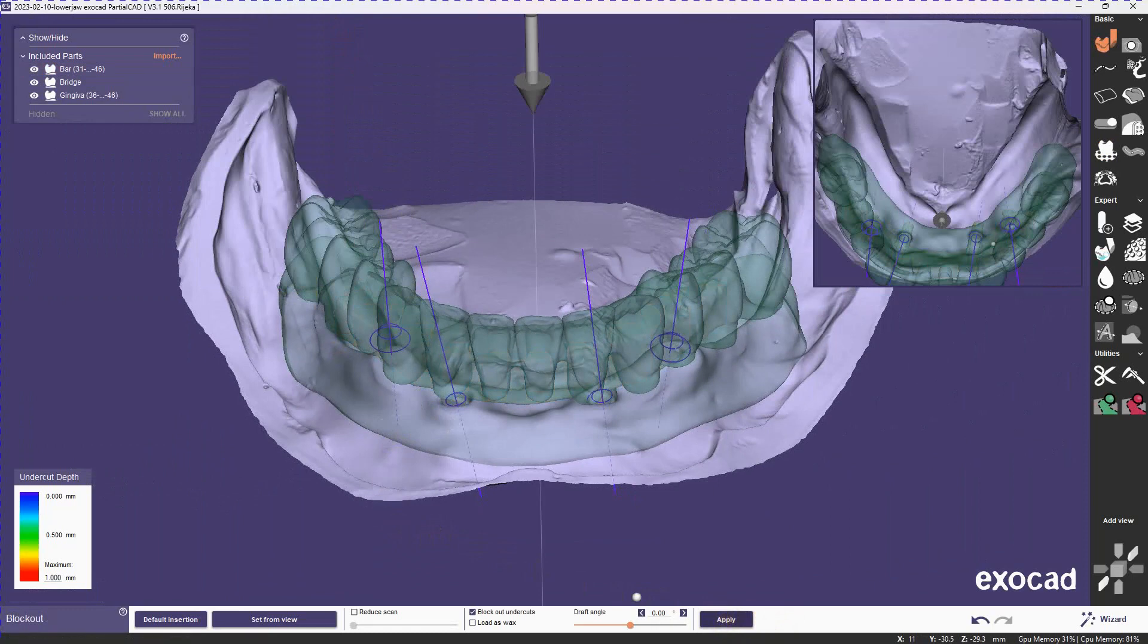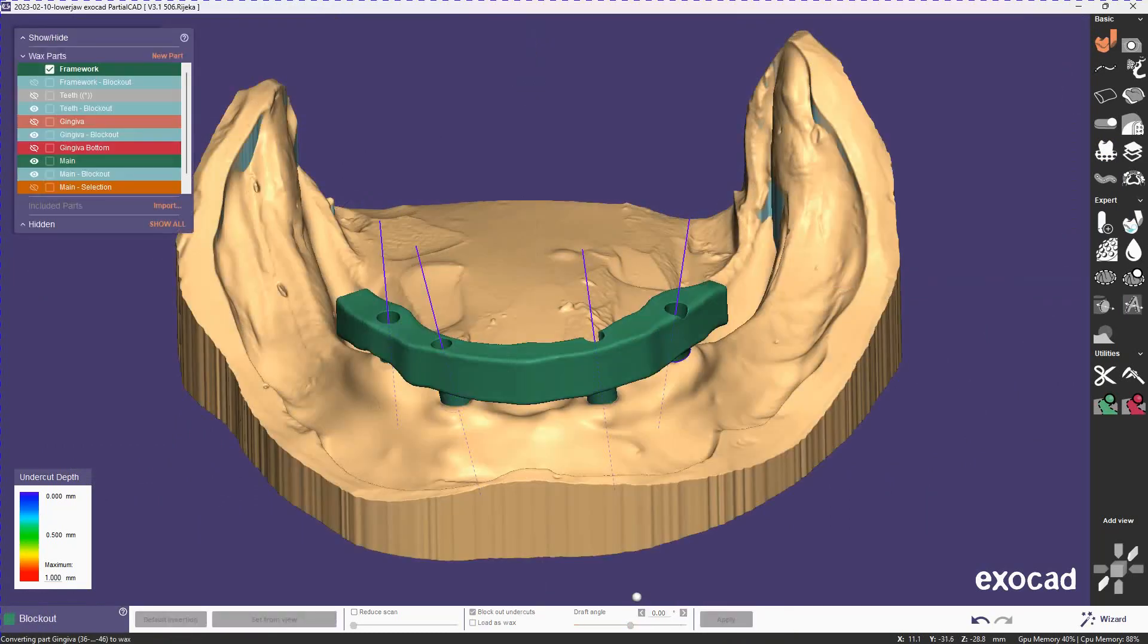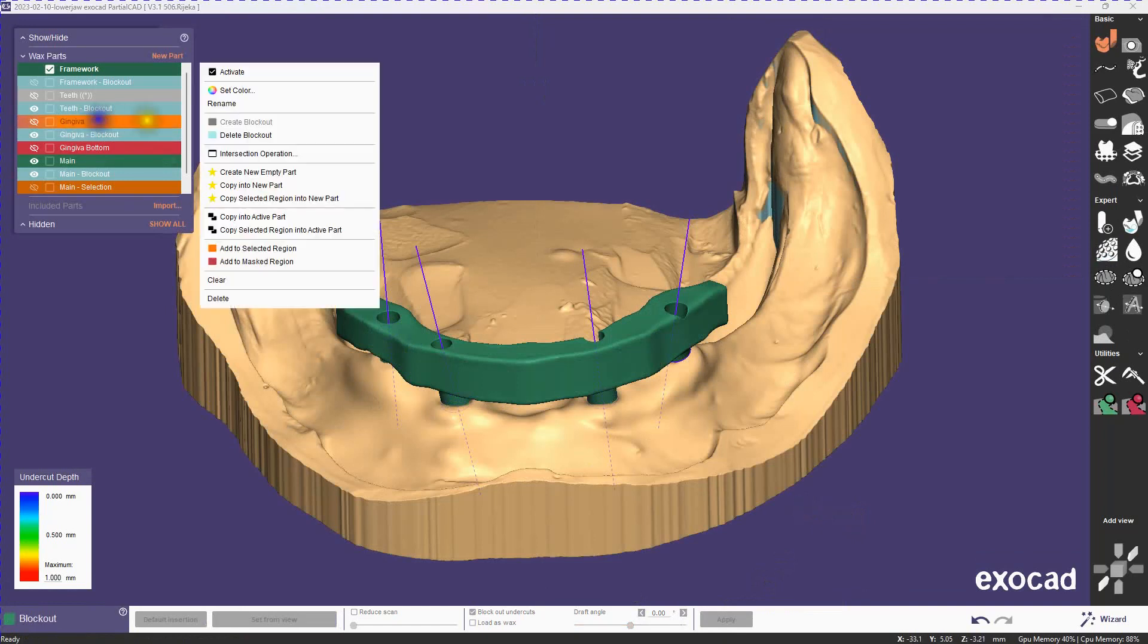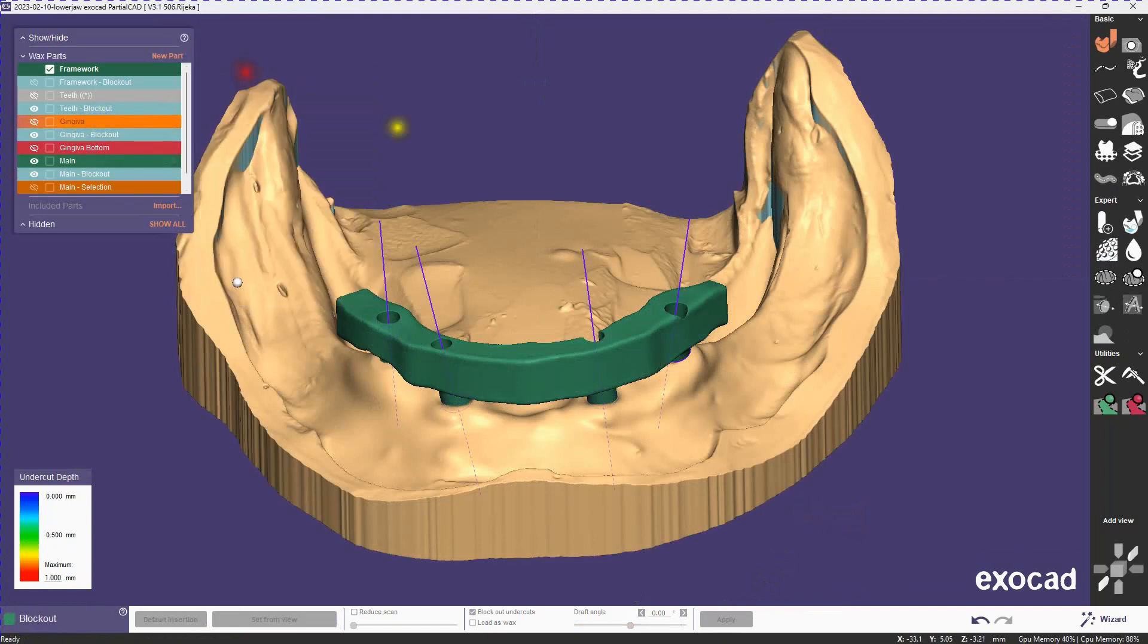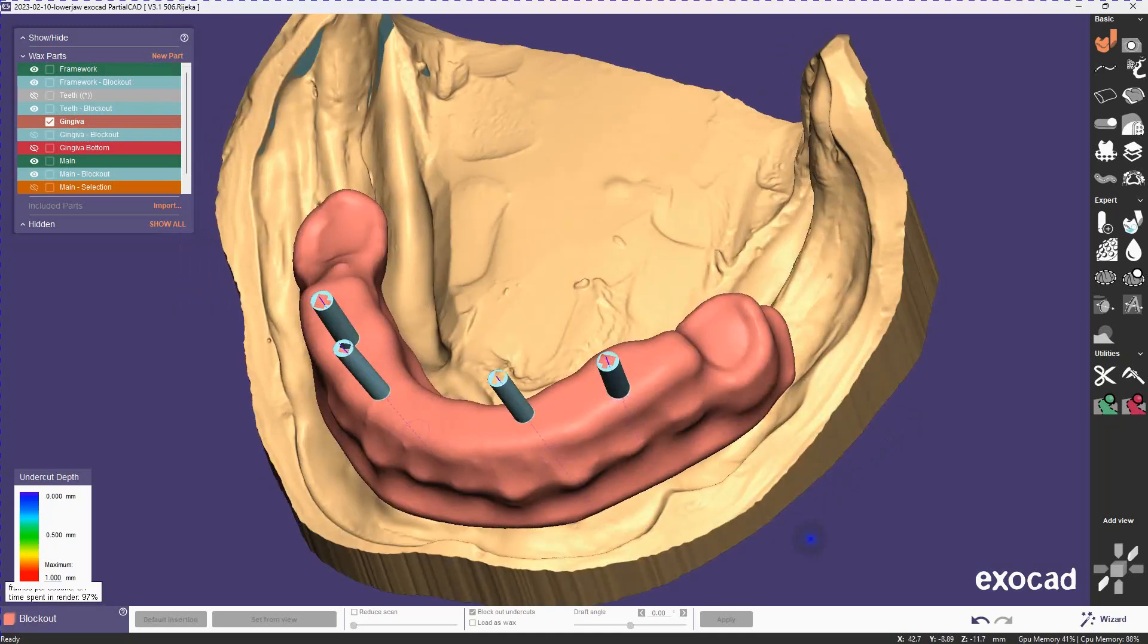So let's apply that. Let's take a look now at the gingiva to see that the screw channels were imported into the block out of the gingiva. So there you see the screw channels sticking out.